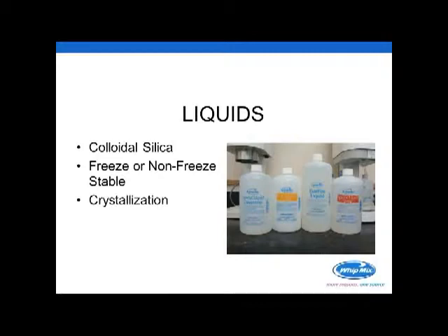These liquids are used to help control expansion. Now, they come in either freeze or non-freeze stable varieties. The liquids that you see on your screen right now are the 4 liquids that are available at Whipmix.